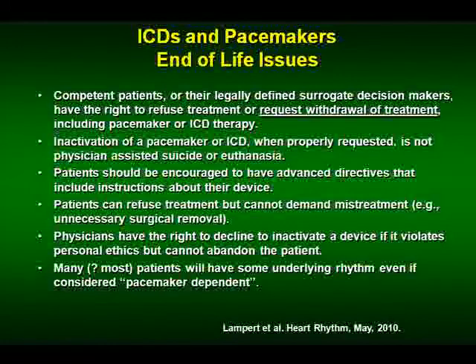The guidelines allow physicians and staff to decline to do it, but you can't abandon the patient. If that's a proper request, and maybe you've had it reviewed by the ethics committee at your hospital, you should get somebody to turn it off. One of the other things is, we often get, he's DNI, turn off his pacemaker.